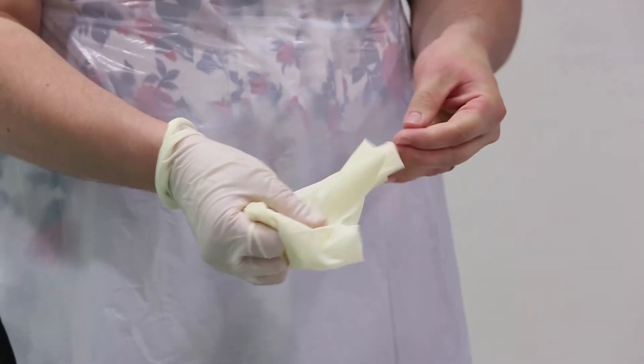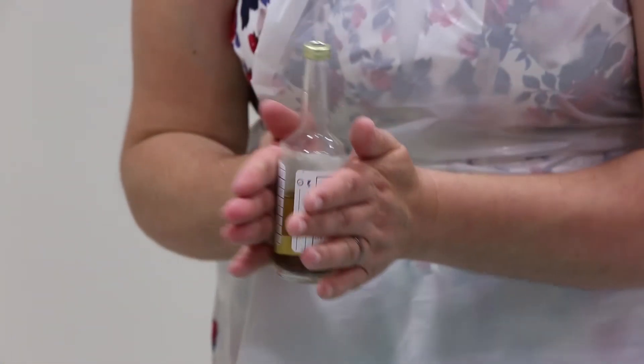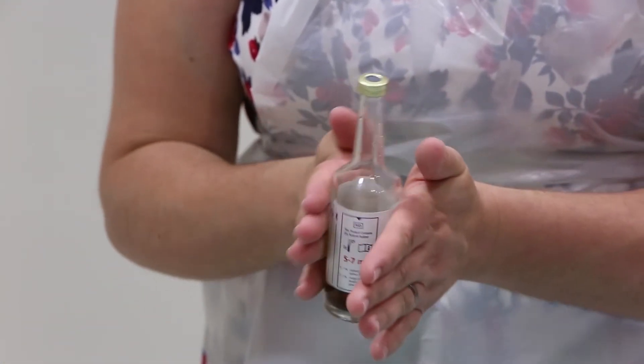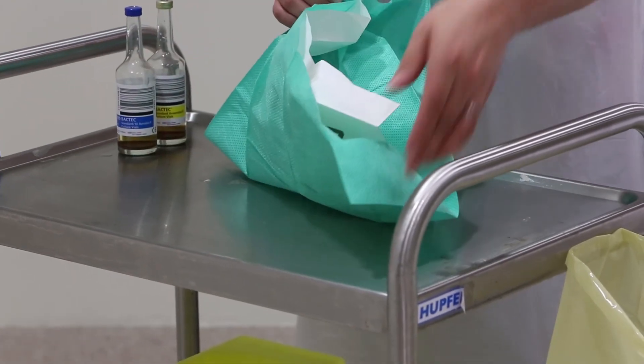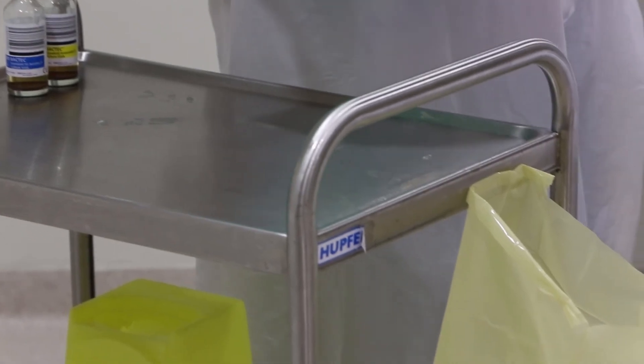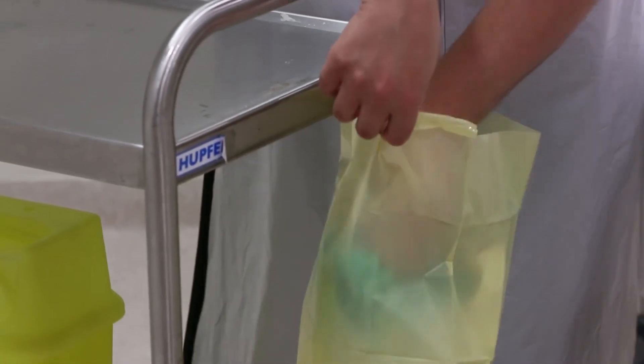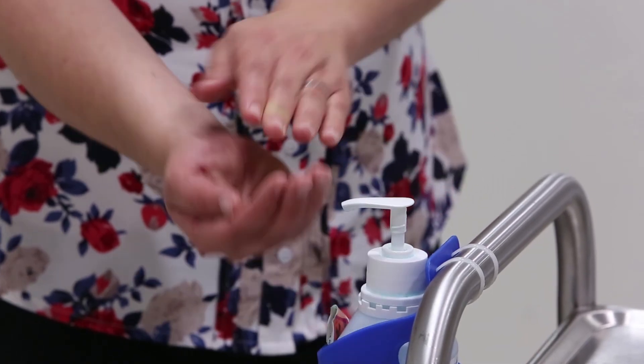Remove your gloves. Gently rotate the blood culture bottles to mix the blood and broth. Do not shake them vigorously. Once ready clear up and dispose of used items using the yellow plastic bag provided. Remove the apron and once again clean your hands with alcohol hand rub.